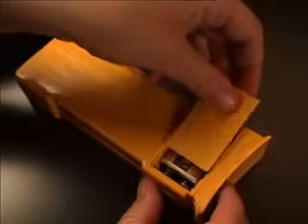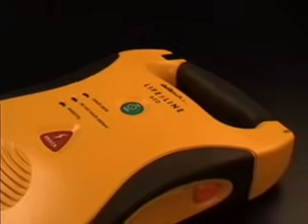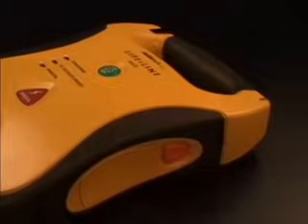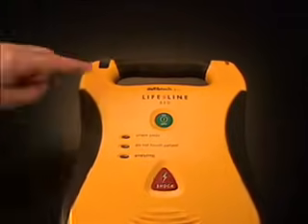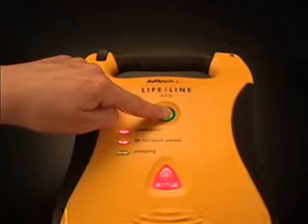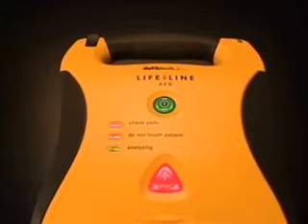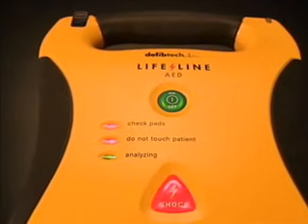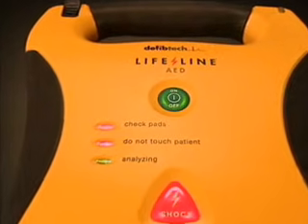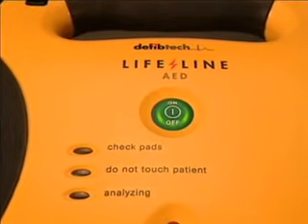When a 9-volt battery is installed in the battery pack, the AED will automatically run self-tests on a regular basis. However, there may be times when the user will want to run manually initiated self-tests. To run a manually initiated extended self-test, begin with the unit off and press and hold the on-off button for 5 seconds until the unit enters self-test mode. The unit will run a complete extended self-test, report its status, and automatically turn off. Be aware that running a manual self-test uses one shock's worth of energy from the battery pack.